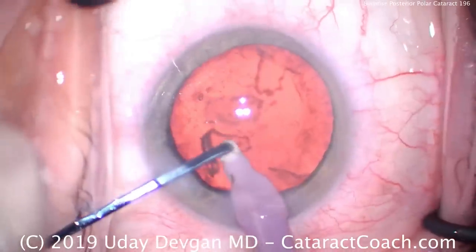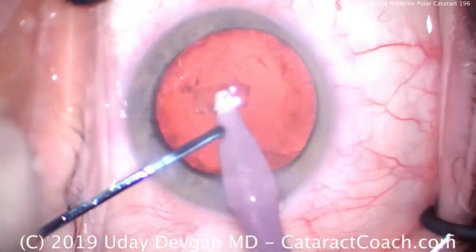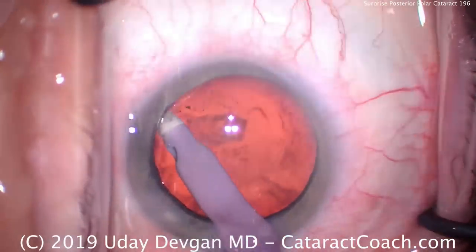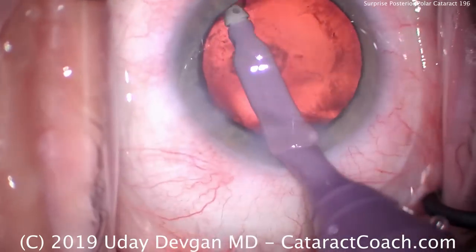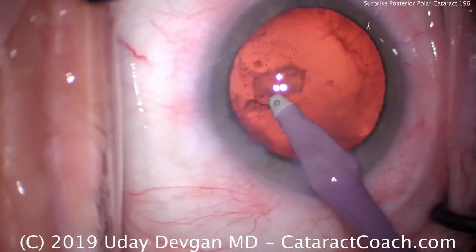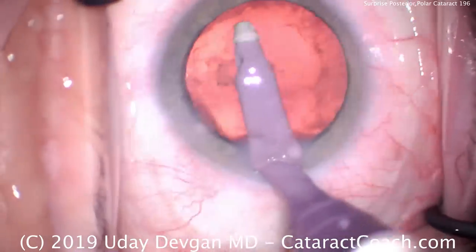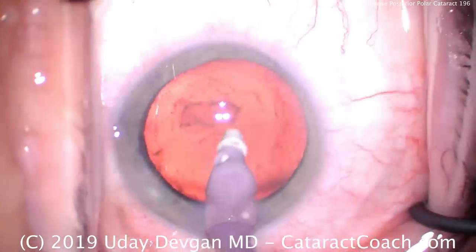We'll try to clean up as much of this lens material as we can around the capsular rim. Again, we're not going for perfection here. This is a very important case to avoid seeking perfection. You want a good result, you want the patient to have a nice outcome, and we don't mind doing a YAG laser capsulotomy later. So let's clean up as much as we can, but we're not going to touch that central opacity.